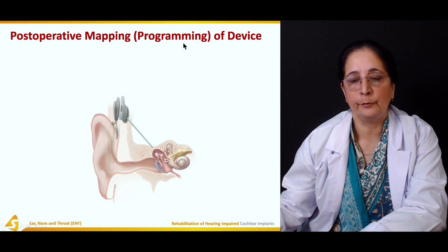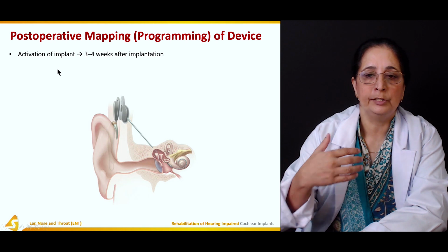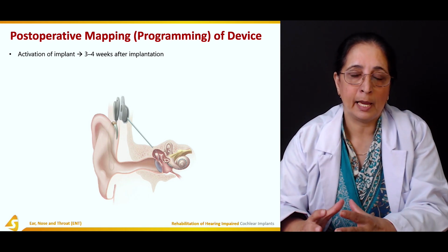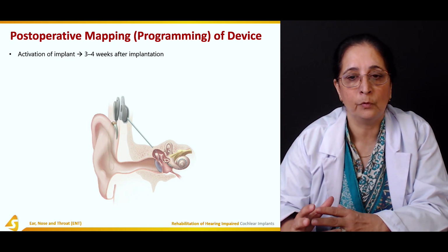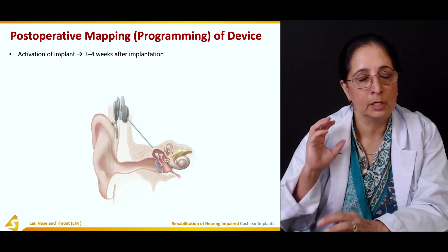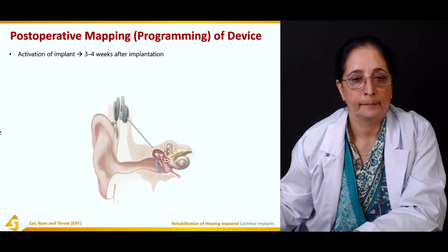Post-operative mapping, programming of the device. Activation is usually 3 to 4 weeks after implantation. Don't activate the equipment right away. It needs 3 to 4 weeks after implantation for activation, so it gets fixed in after the surgery.